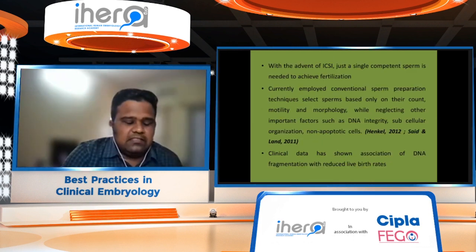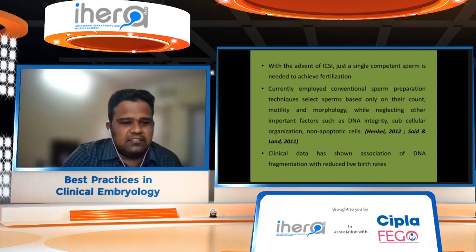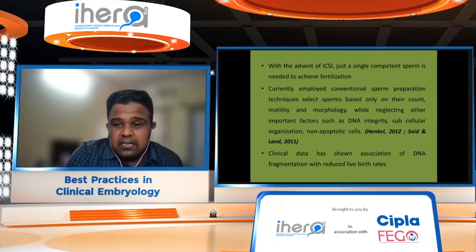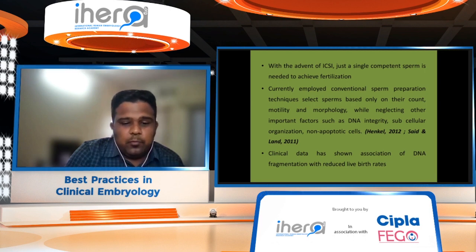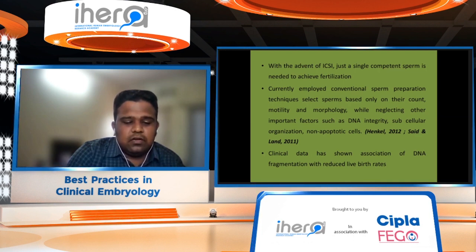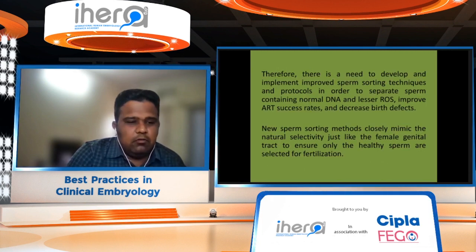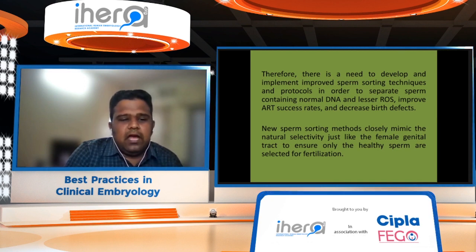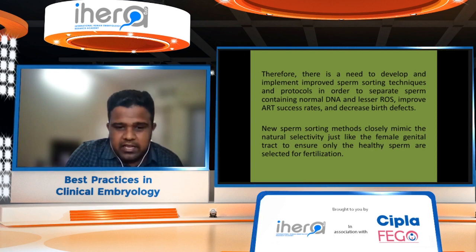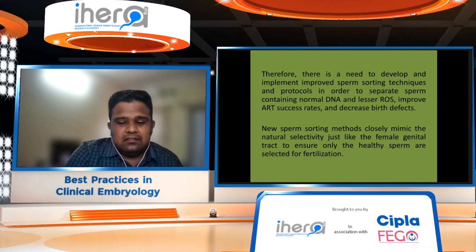Now, yes, as rightly said, with the advent of ICSI, there is only need of a single spermatozoon to achieve good fertilization. Currently employed conventional sperm preparation techniques basically neglect parameters like DNA integrity, subcellular organization, apoptotic parameters, whether the cell is alive or not. Clinical data has shown an association of live birth rate and DNA fragmentation in the outcomes. Therefore, there is a need to develop and implement improved sperm sorting techniques and protocols in order to separate sperm with normal DNA, lesser ROS, improved ART success, and decreased birth defects.